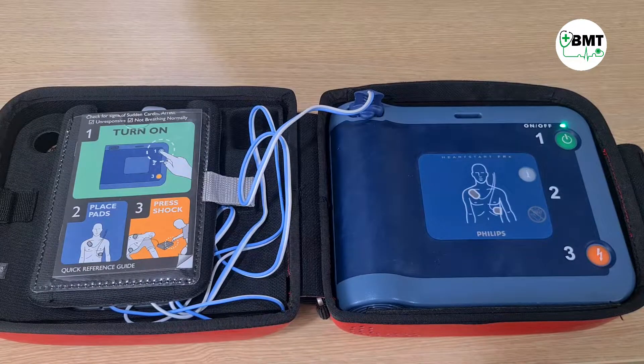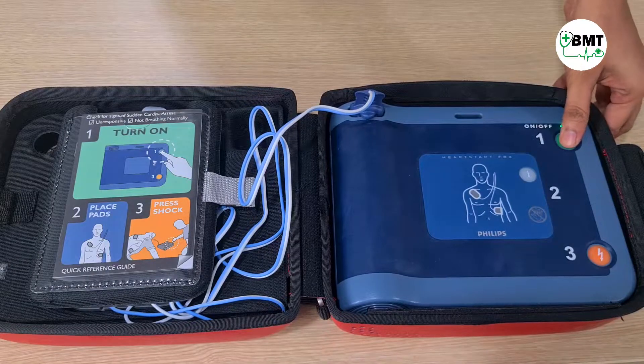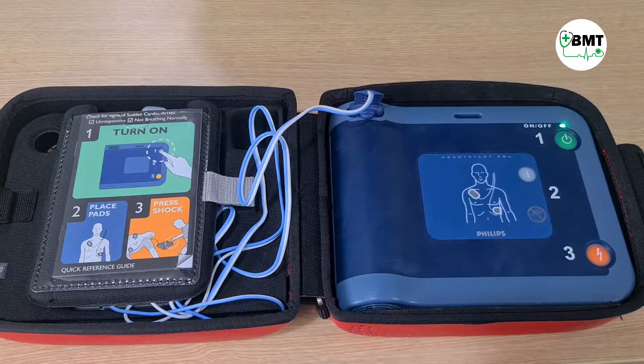On-off button test: press the green on-off button now. Verified. Testing. Ready for use.